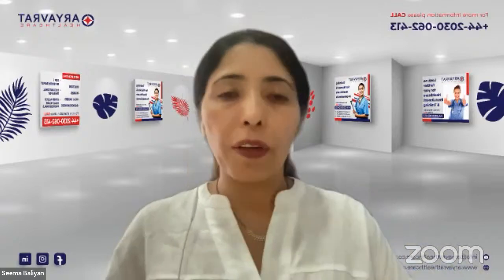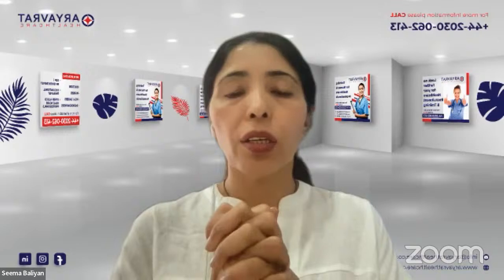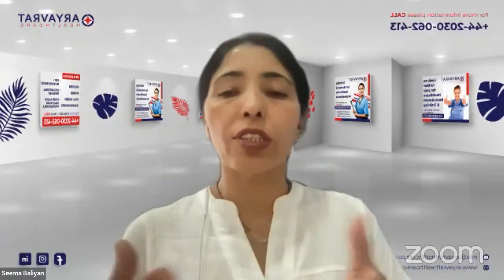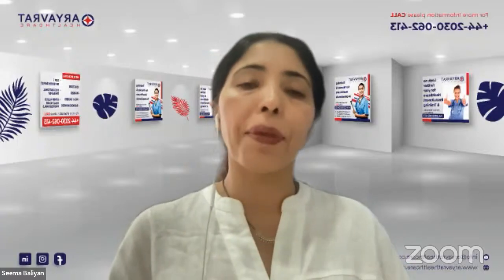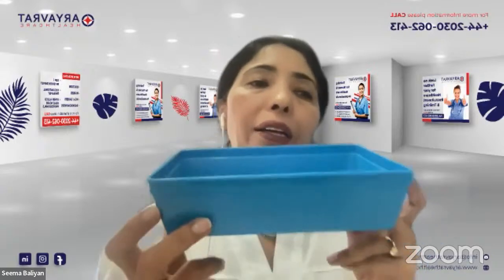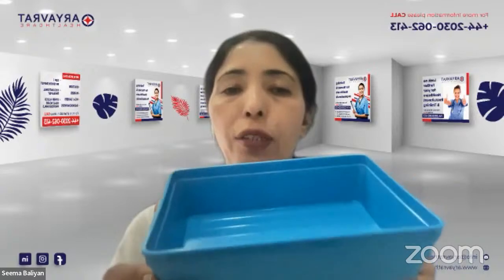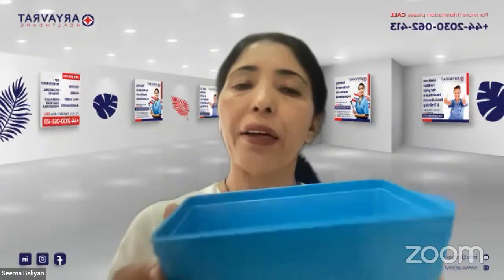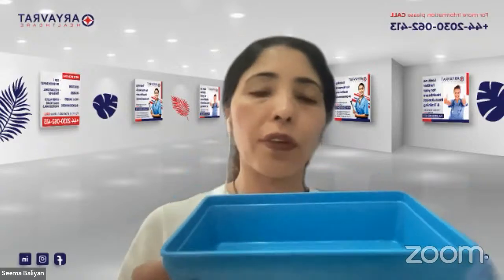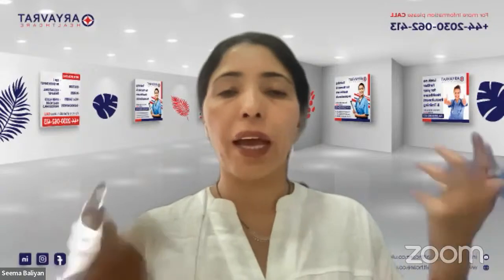So the first thing when we go to collect the articles is that you are going to do your hand hygiene. And while doing the hand hygiene, you can always check with your examiner: is my tray, in which you are going to keep all of your articles, cleaned with soap solution in the last 24 hours? If the examiner tells you that yes, it is cleaned with soap solution in the last 24 hours, after that you are going to put on gloves and apron.